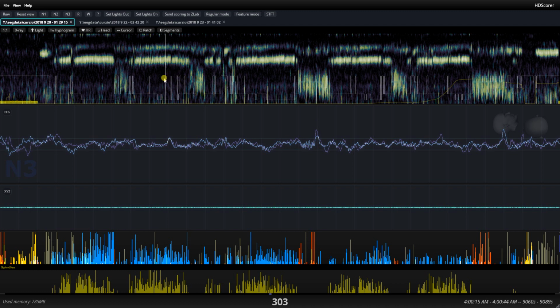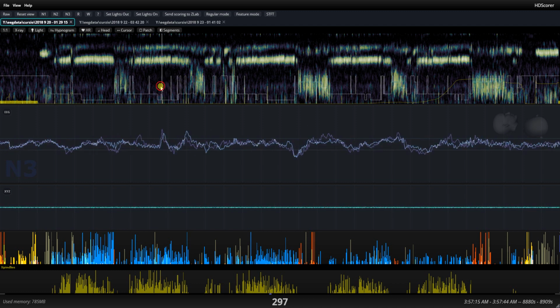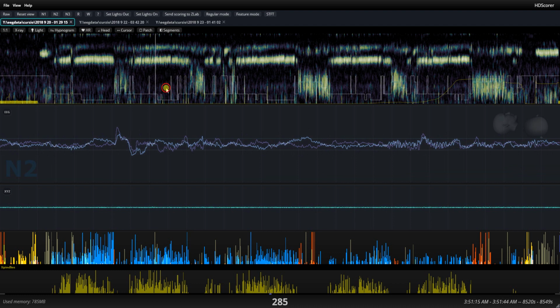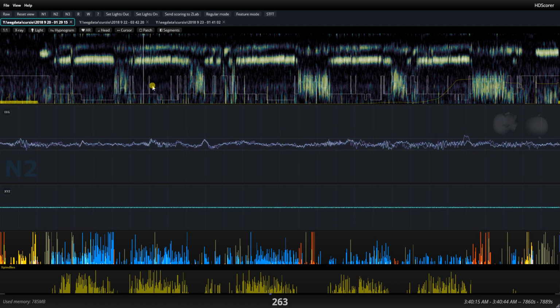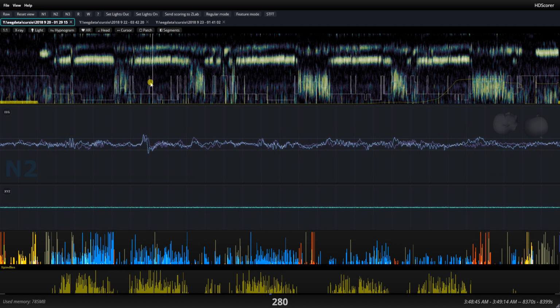For validation purposes, I'm still waiting for scored files. Sorry, there's no way to shut down every single device that can potentially blink and beep. What I was saying is that I'm still waiting to see if this is the way I want to do it, but this is the way it's working for now. It's trivial for me to just judge each epoch based on its own sleep depth, but I think this way is more repeatable.